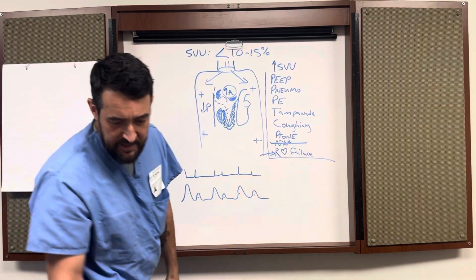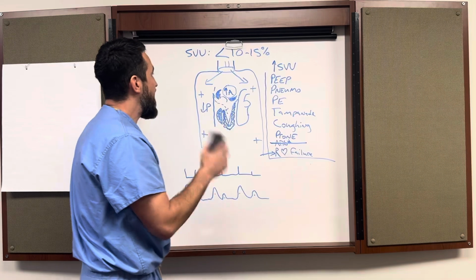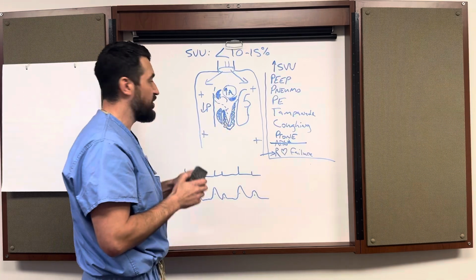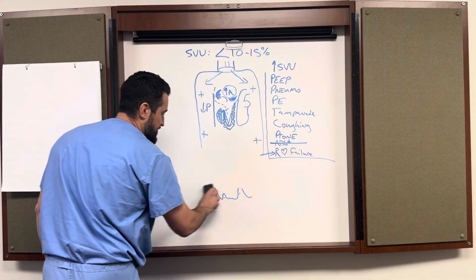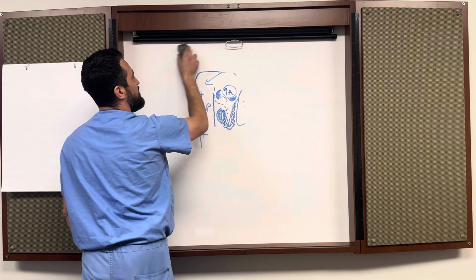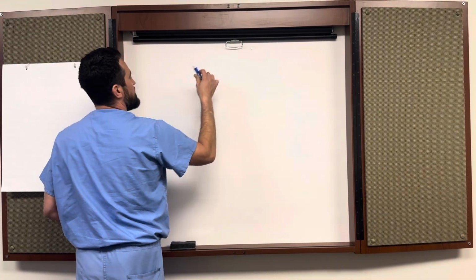With our newest technology, the Acumen sensor, we now have a new parameter that helps us clear up the SVV dilemma of whether or not we're looking at something that's a volume issue or not. Let me explain the dP/dt really quickly. So dP/dt is going to be a contractility indicator. It's change in pressure over change in time. And so it looks like this.